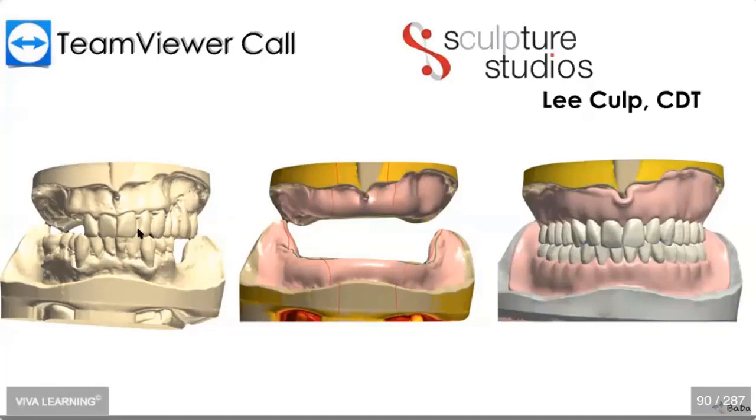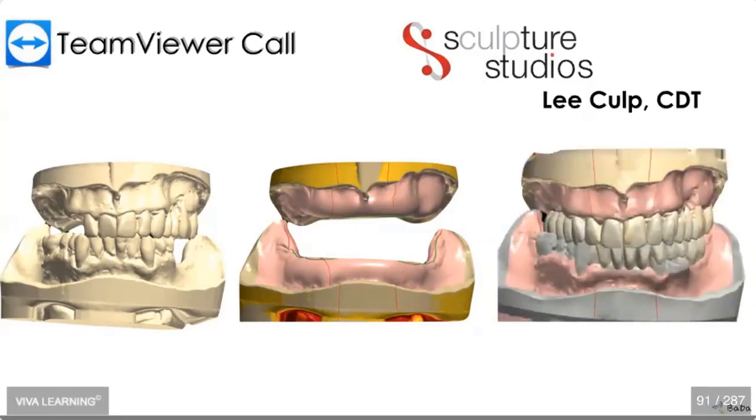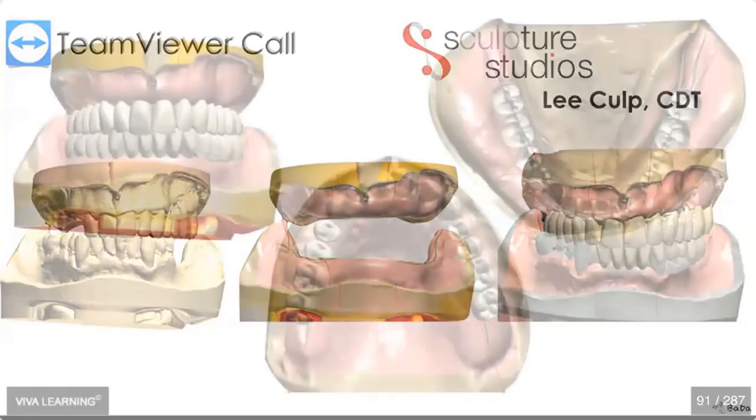Now I sent the whole thing to Lee, and what Lee did is a virtual surgery on the cast, and then the teeth were set up according to some anatomic landmarks requested by the 3Shape software. And then here you can see a superimposition of the existing dentition and the shape of the dentures, how it's going to be at the end.